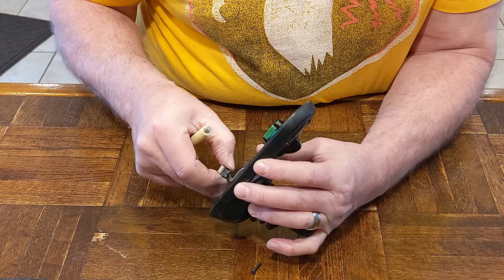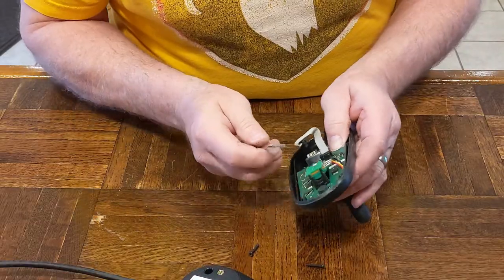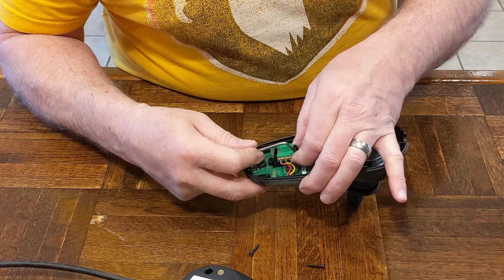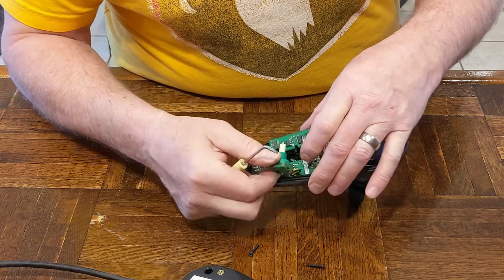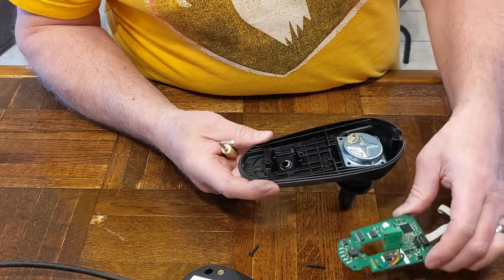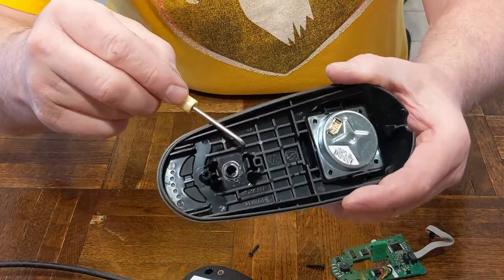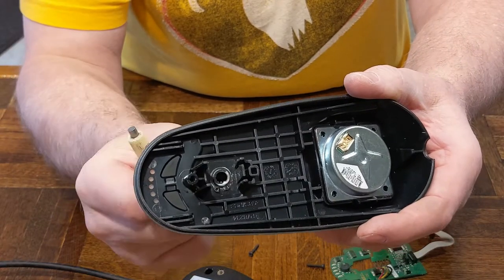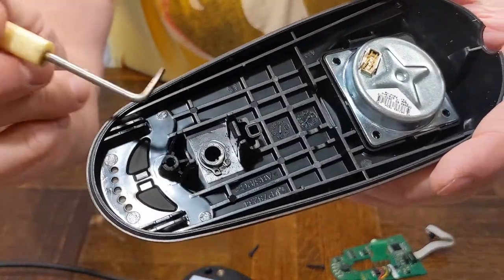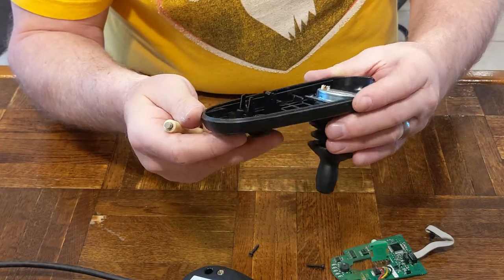That connection is for the joystick. I'll disconnect it and remove the potentiometer. You can see there's an e-clip in there that retains the knob, so no amount of prying is going to get that knob out. I'm glad I didn't try to work on that aspect of it.